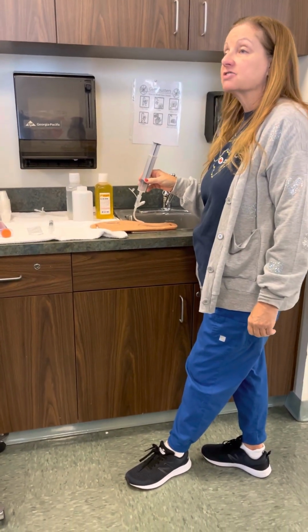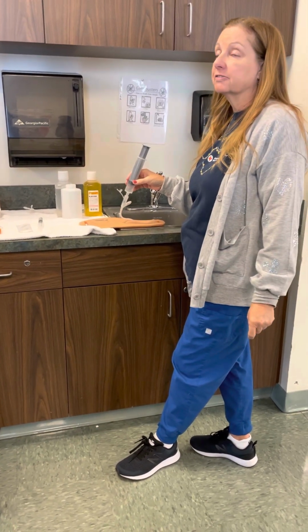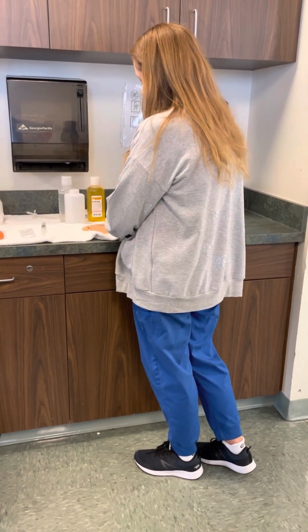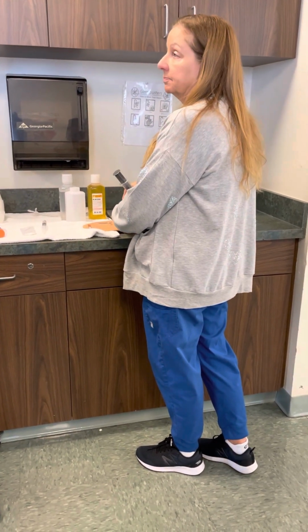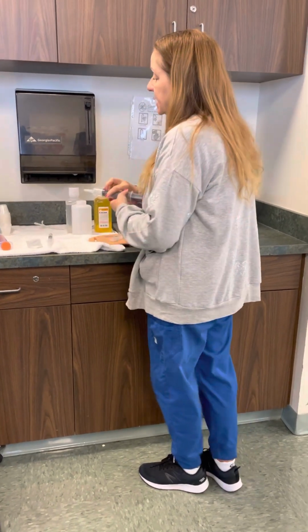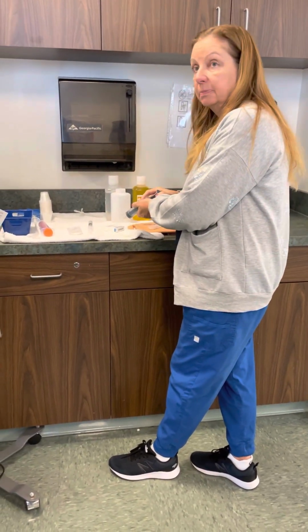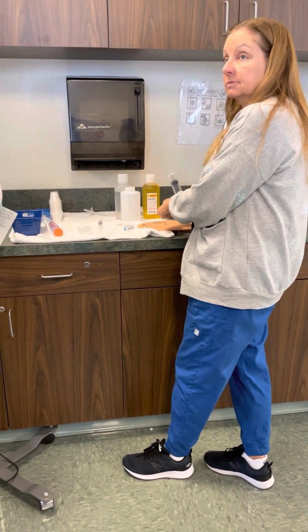Yes, we're checking the gastric residual volume, right? If it's greater than 500, we're going to hold it for 2 hours and notify the physician. Okay? So after we get some gastric contents in there, I pull back as much as we can get. Sometimes there'll be nothing in the stomach. And then I'll take my pH paper and squirt a little bit of the gastric contents onto that.